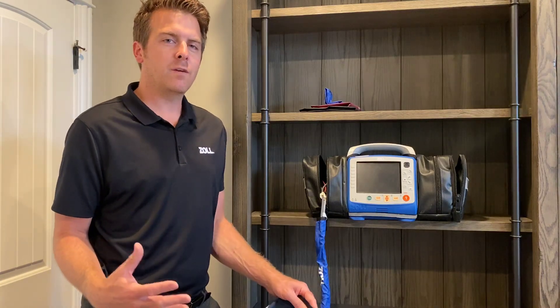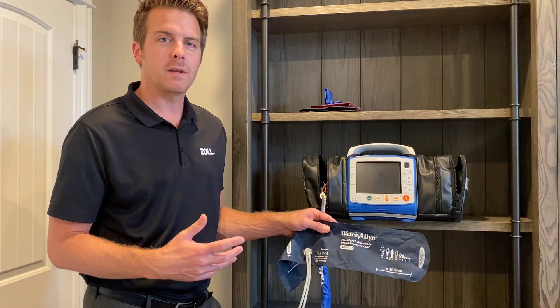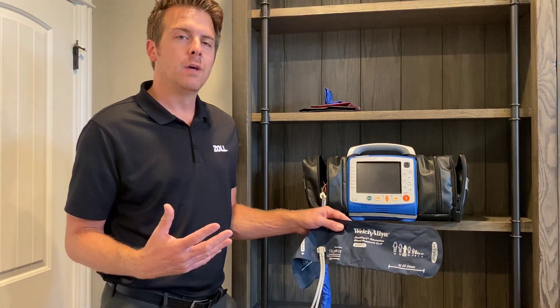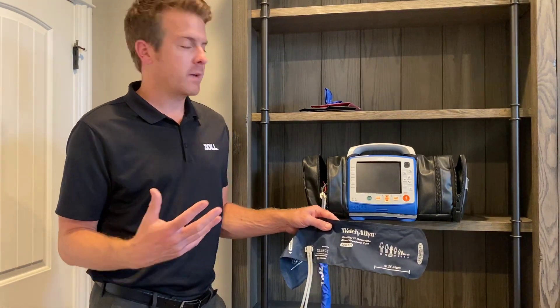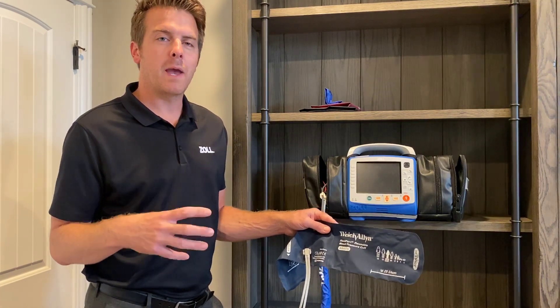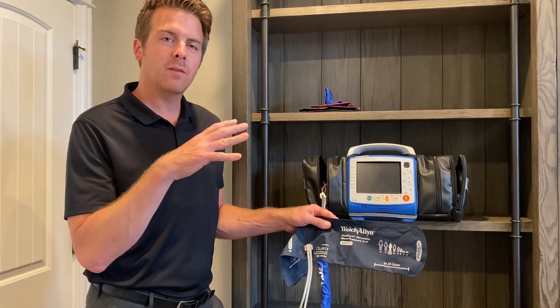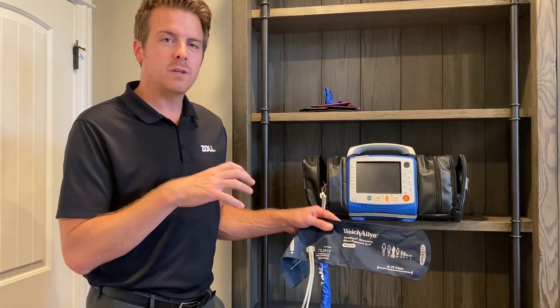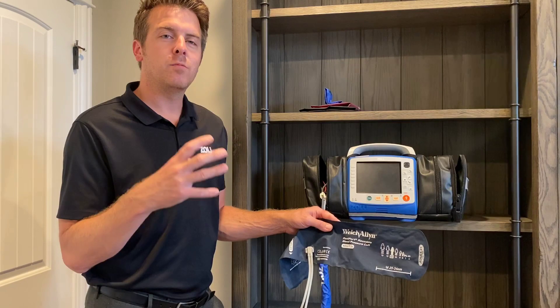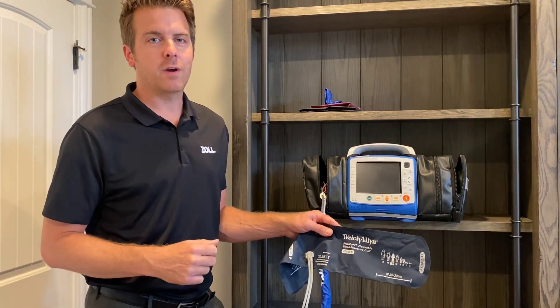The first thing we want to talk about is a general understanding of what the X-Series and the Welch Allyn blood pressure technology are trying to accomplish. In its simplest form, the technologies work together to try to mimic what you would normally be doing taking a manual blood pressure. At the same time that air is inflating the cuff, the technology in the X-Series is also trying to match up that inflation with the heartbeat of the patient that you have the cuff on.